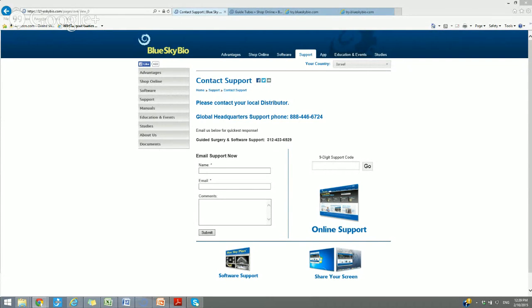Some printers that I've heard about that reach that level of accuracy is the Titan 1. That one, I think, has very good reviews in terms of cost, in terms of print speed, and in terms of accuracy. Some other ones, I heard of one from Formlabs, the Form 1 printer. So those are two printing options as well. But if you're getting a 3D printer, then you want to look at the slice thickness, at the accuracy level. You want something that's around 20 microns.